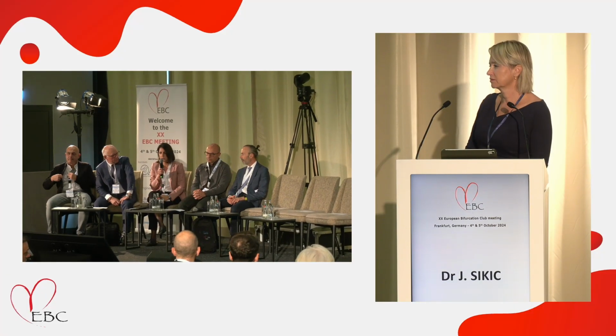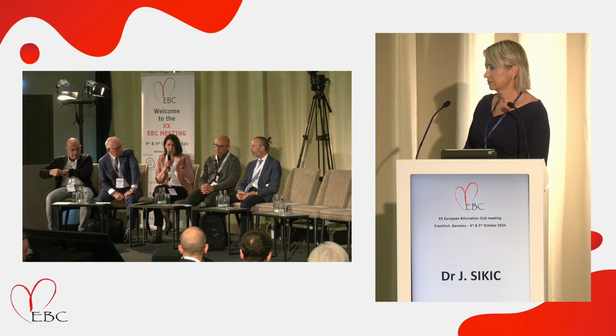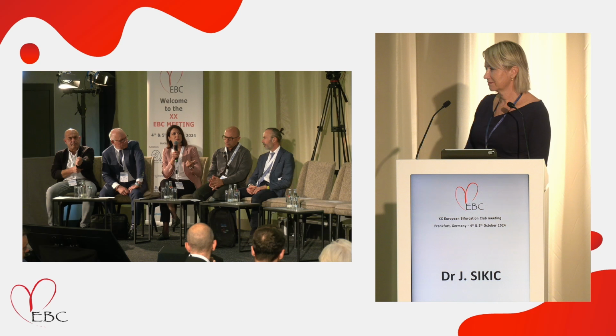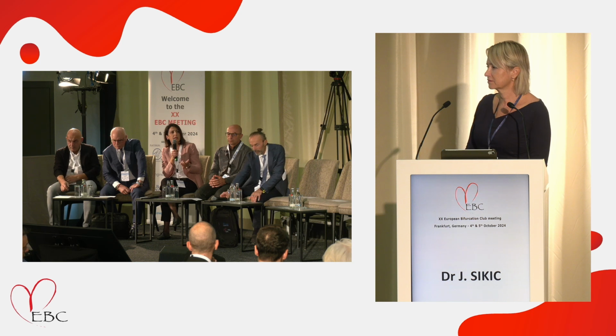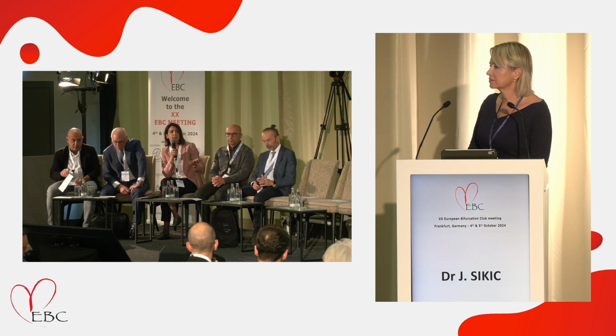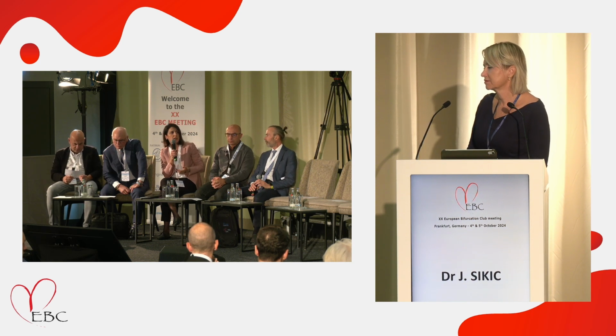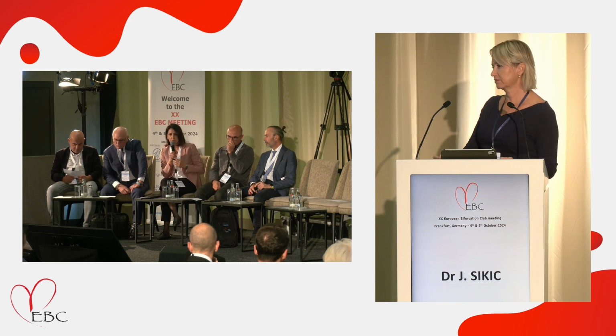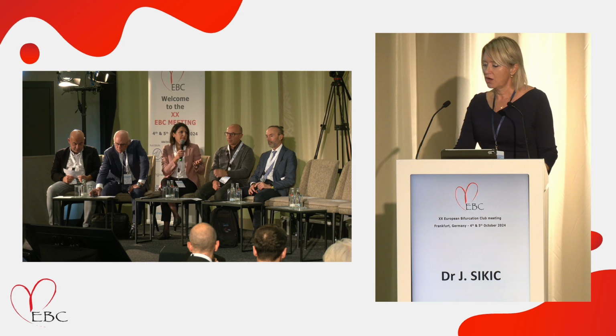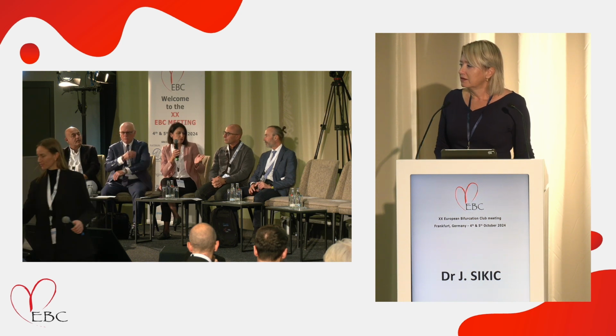And what was the reason? I really like to use DCB when it's possible, feasible. And so you used rotablation, cutting balloon, and the DCB, and the result is good. And really, this is one of the examples that DCB can be done also in severely diseased and calcified lesions. So this was just a comment. I don't know what to add, but really a nice example.